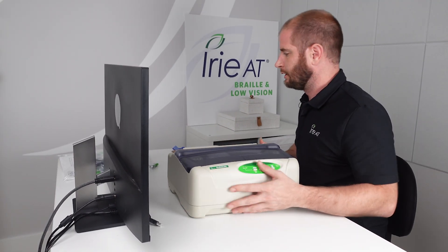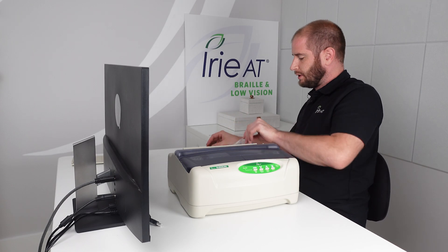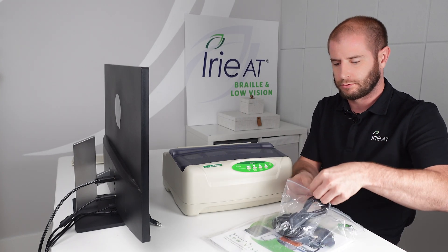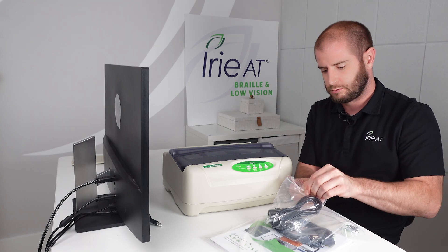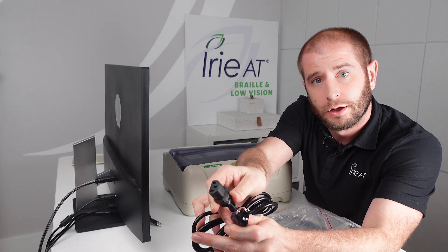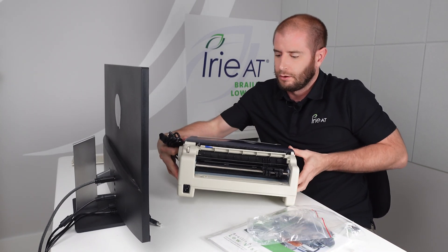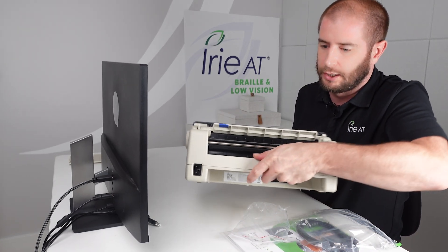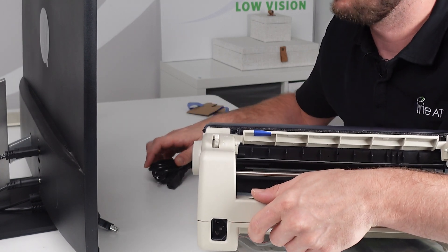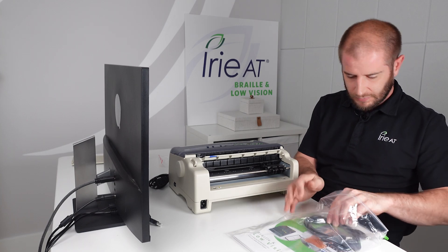We can go ahead and store the shipping locks in the plastic baggie that came with the BrailleBuddy. Now let's cover what comes included in this baggie. Of course you're going to have your traditional power cable — one end plugs into the wall and the other end plugs into the back of the embosser. The power plug is on the left side of the back if you have the back facing you.